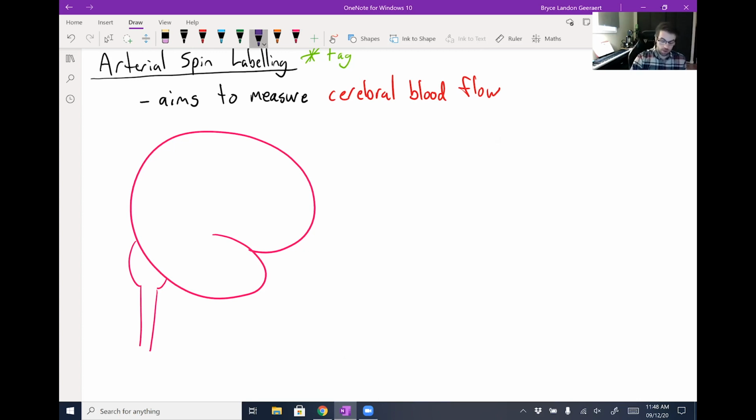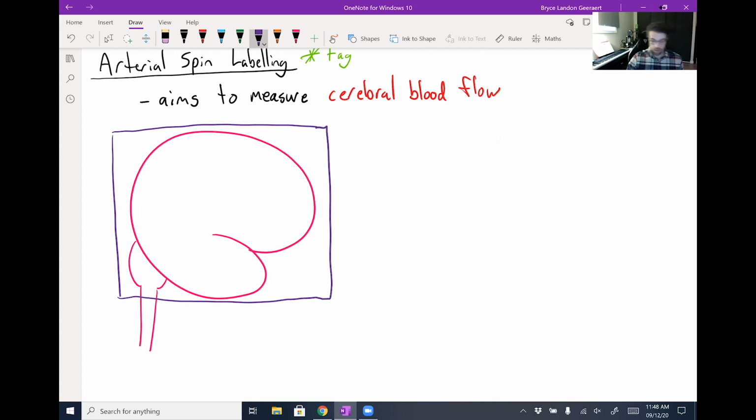So if you want to look at how much blood is flowing into the cortex, we'll just put the cerebellum to the side. I love the cerebellum, it's amazing, but just to focus on the cortex for now. Just to keep the perfusion distance similar, as blood is coming in from your carotid arteries and spreading out to the outsides of your brain through several major arteries.